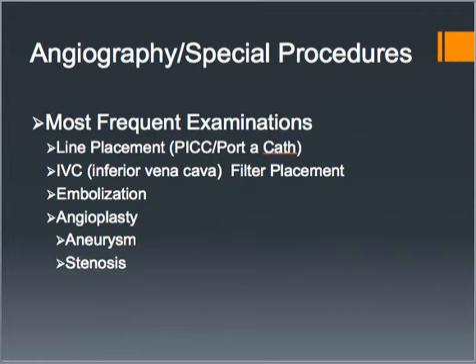IVCs, or inferior vena cava filter placements. The inferior vena cava is meant to carry blood from your lower body to your heart and lungs. So if there's blood clots lodging in the lungs or the heart, that can be really deadly. So an IVC filter is placed in your inferior vena cava to prevent that clot from traveling in your blood into your lungs.